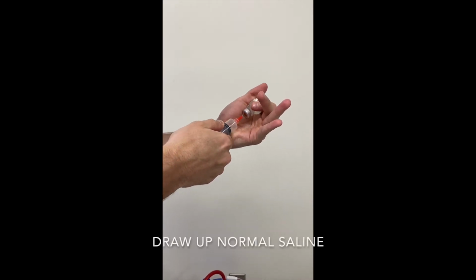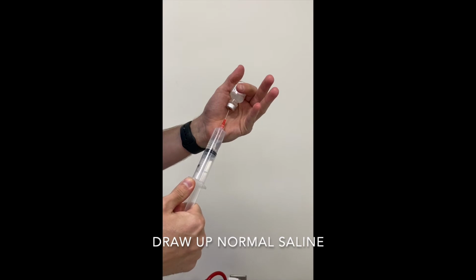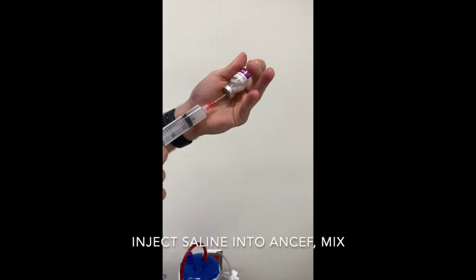Here you can see this example of reconstituting a medication again up close. He injects a small amount of air into the bottle and then draws up all of the saline. He then injects the saline into the antibiotic powder and mixes.